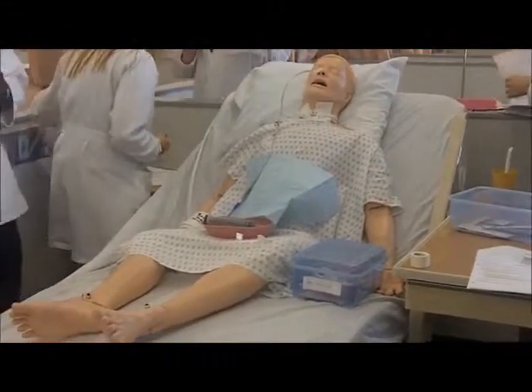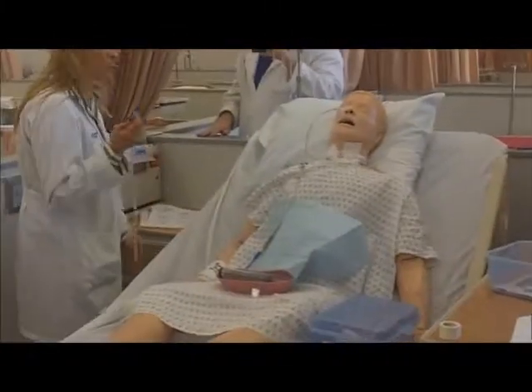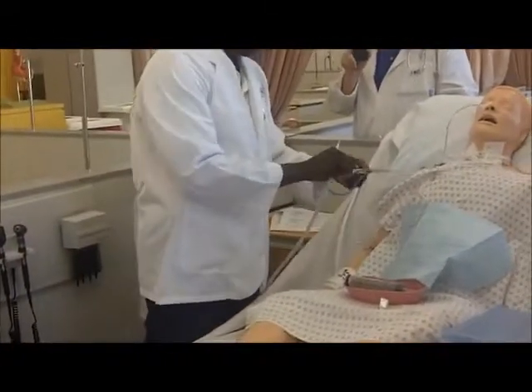So you just come over here. So you get a chest X-ray before you put it into suction? We're missing something, a little connector. Go ahead and show me where this gets connected. I'm gonna remove this.